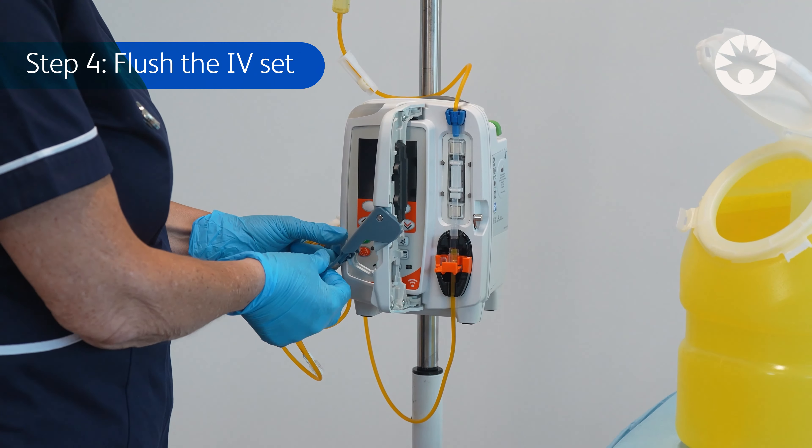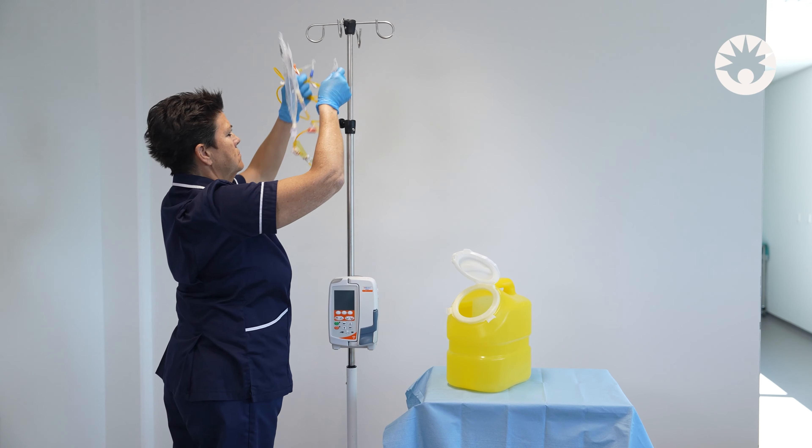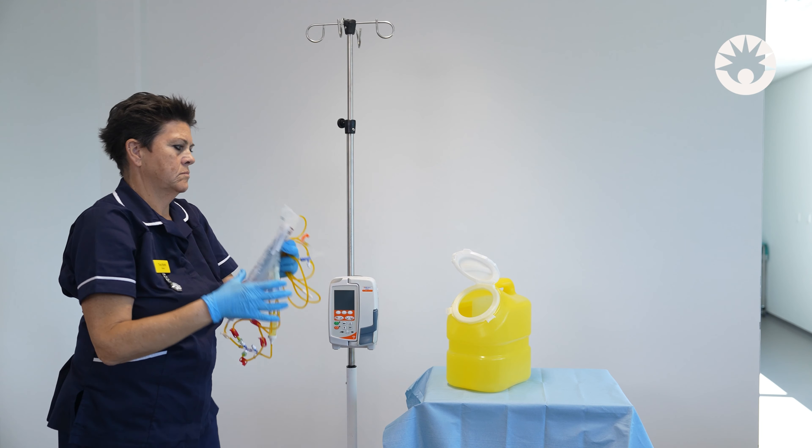After the last drug infusion is finished, flush the primary set again. The closed system can be disconnected. The set is ready for disposal as a closed system.